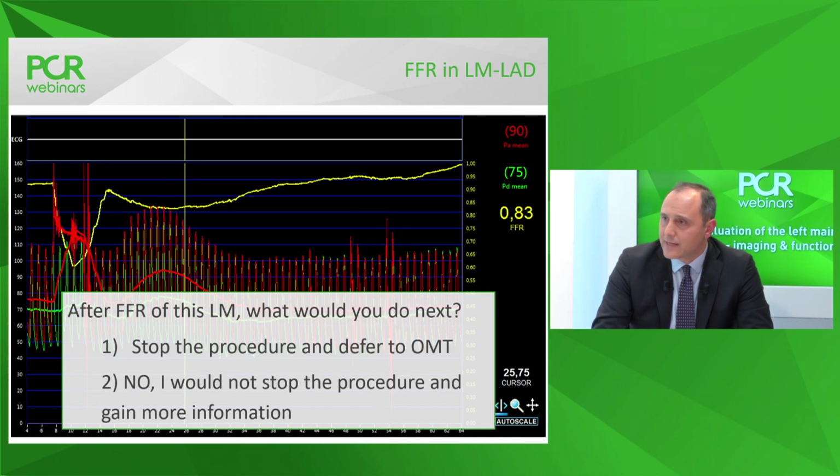What to do next? And I will start with you now, Gabor. Would you stop the procedure at this time and, based on the angiogram together with the invasive functional assessment, defer these patients to optimal medical therapy, or would you rather do something different?